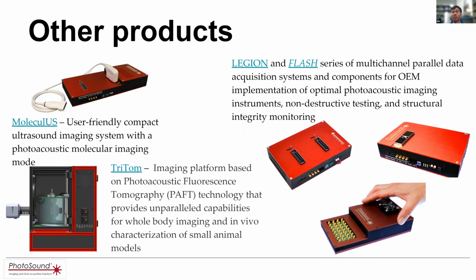Fortunately, the radiation-induced acoustic signal is within those ranges, so we are able to see something. But the best choice is still a custom transducer designed to match the spectrum of the radiation-induced acoustic signal.